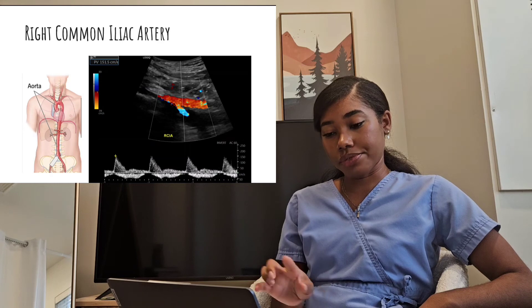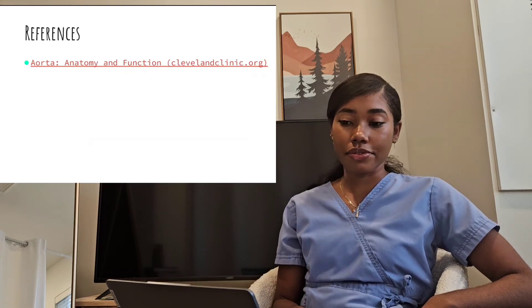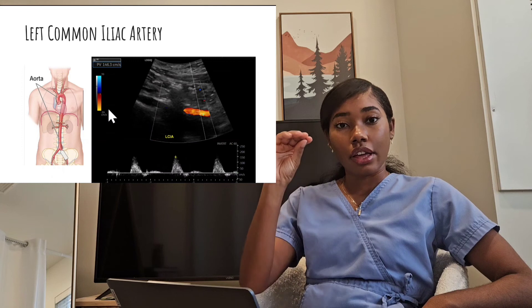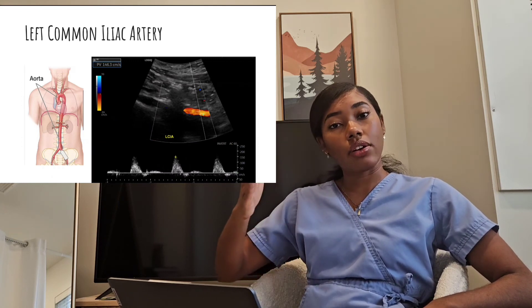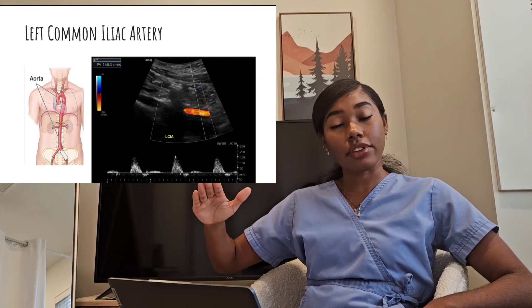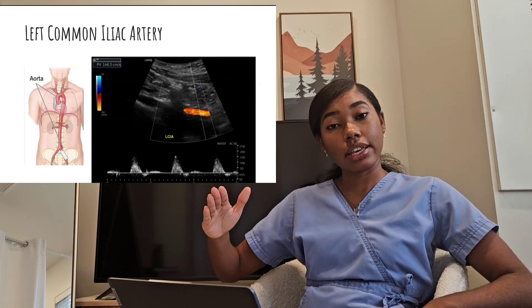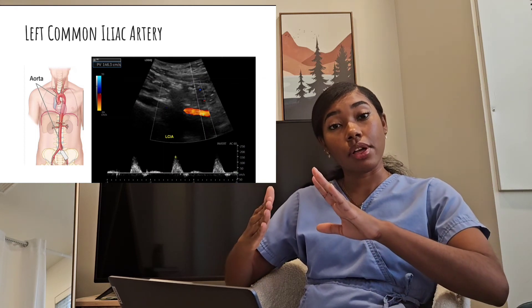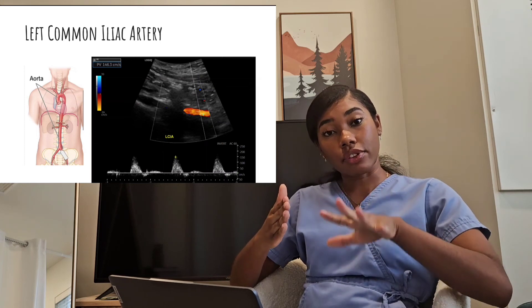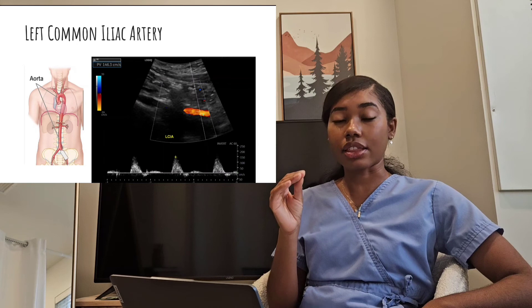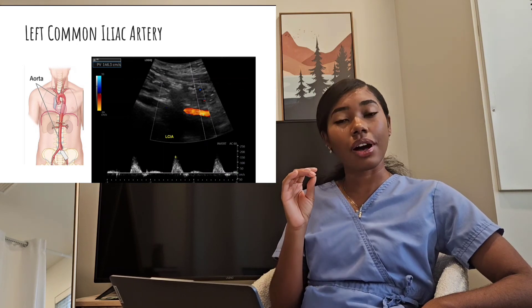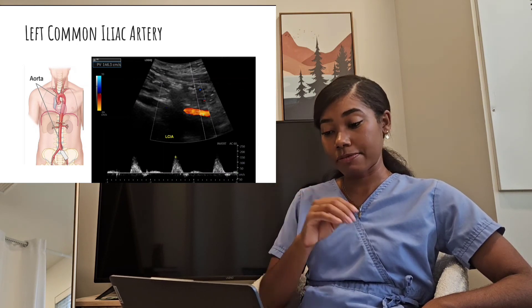Then take the color and pulse wave Doppler image. For the left common iliac, do the same thing — slowly turn on it or angle all the way out to the patient's left, slowly angle in with color flow on until you see flashing color flow. The first vessel you come in contact with should be the left common iliac artery in the pelvis, then take your color and pulse wave Doppler image.